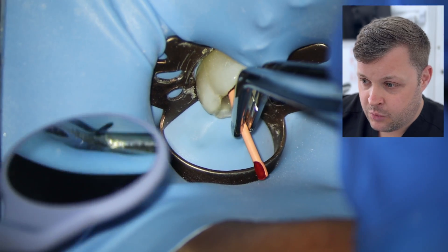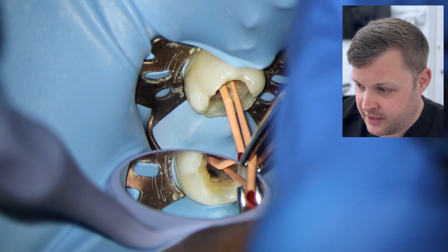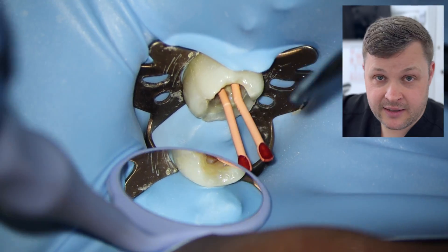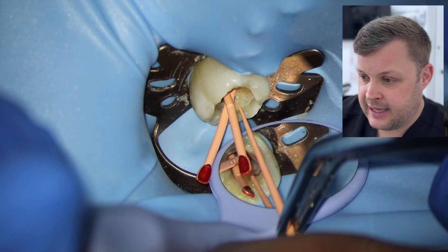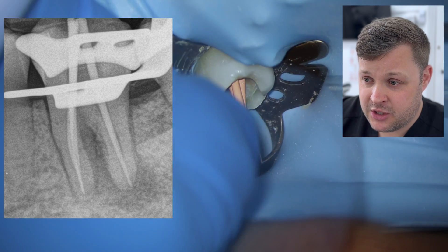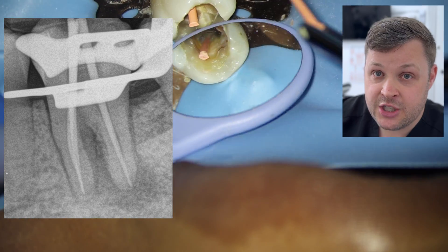Once we've done all our disinfection, we prepare for the cone-fit radiograph. What I like to do is fit all the cones to length, then snip the ends off right at the end. This stops the GP points being pulled out when you remove the rubber dam frame and move the rubber dam, which would otherwise pull the GP points out. Looking at the x-ray, it looks really nice — it looks a bit straight, which is sometimes a bit of a red flag, but I don't think I've pushed these files too much. I feel that is the anatomical representation of the tooth.